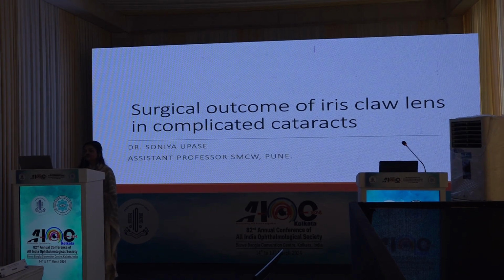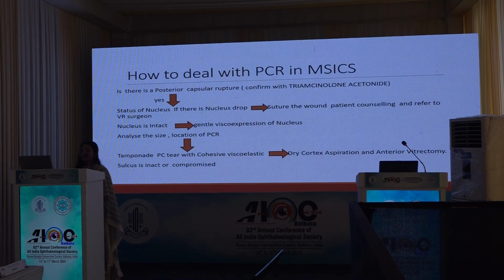My next talk is surgical outcome of the iris claw lens in complicated cataracts. Now, how should we deal with the PCR in cases of manual small incision cataract surgery? So we should first see whether there is real PCR or not. Whenever we are in dilemma, we should confirm it with the triamcinolone acetonide injection into the intracameral site.